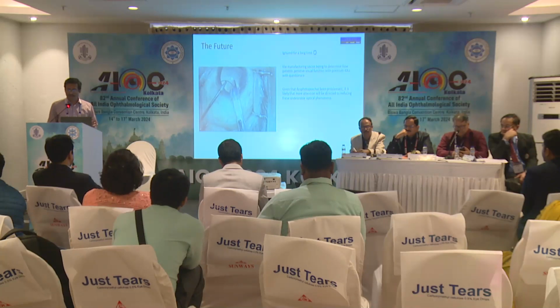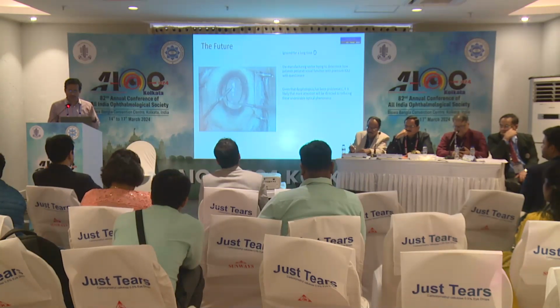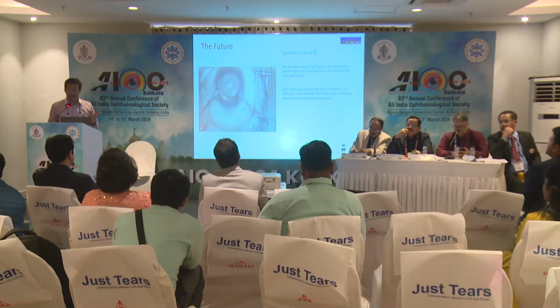So we have ignored it for a long time, saying that it will go away on its own. Wait for some time. But with premium IOLs coming into play, when somebody walks in at the first postoperative visit and says, I'm having this negative dysphotopsia, black shadow, do something for me, why is it there?